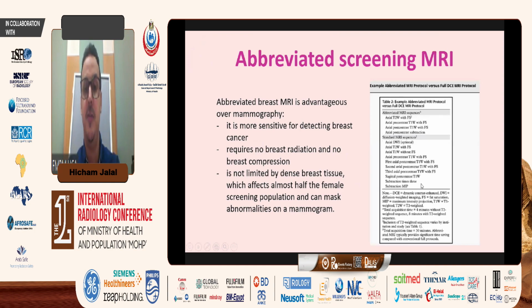And now the fifth modality is the abbreviated screening MRI. What is abbreviated screening MRI? As we know, in the American experience, even if MRI is indicated in high-risk women, only 15% of women tolerate MRI because of the long time, the claustrophobia, and the cost of the exam.